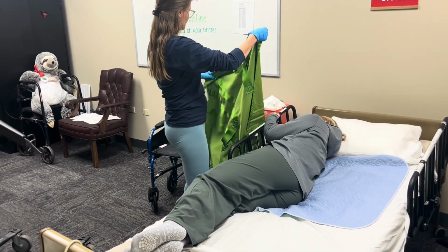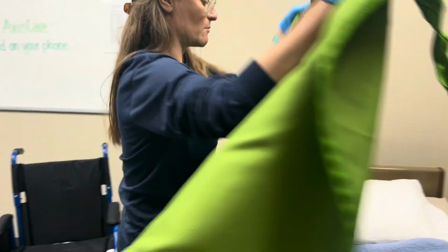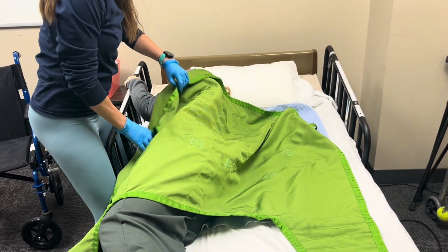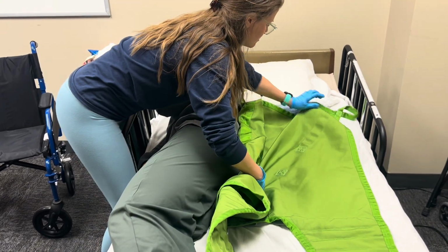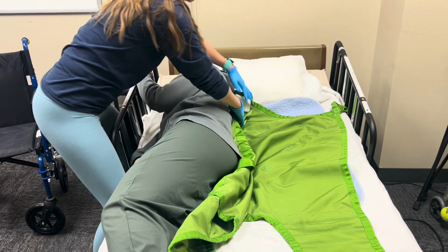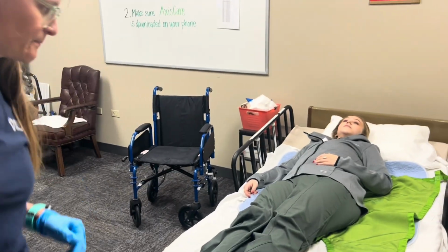So getting the sling, the instructions here say that this is facing up. So what I'm going to do is put the Hoyer sling, kind of the same way that I set up sheets when I'm changing sheets on a bed-bound patient. So I'm going to roll the Hoyer sling underneath, and I'm going to do a little bit of a tuck, okay? You're going to feel a little bit of a tuck, Miss Michaela. All right. Can we roll onto your back? Great. I'm going to come to the other side.